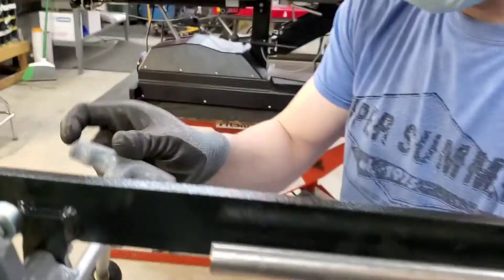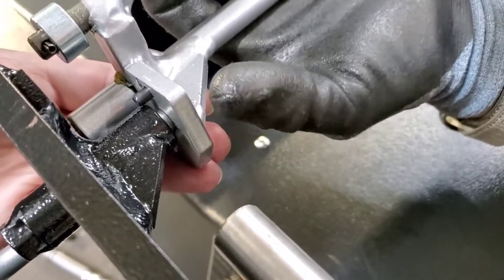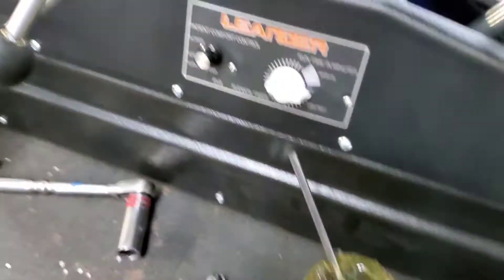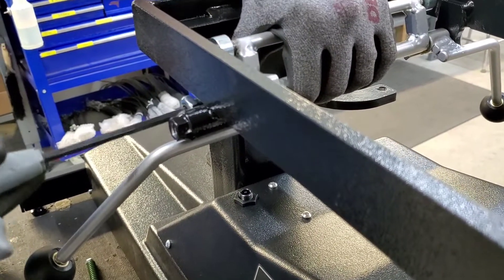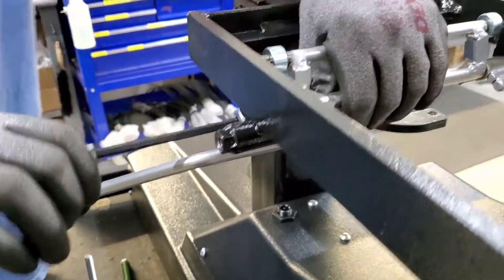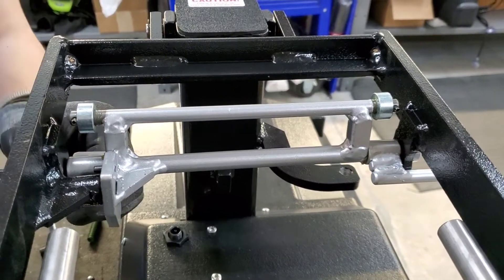Starting on the non-tension knob side, screw the set screw in with the nut until you can see a small gap between the ball bearing and the plate — somewhere between a 1/16th and 1/8th of an inch is fine, but you still want to be able to see through there. Then on the tension knob side, screw it in until you start to feel some resistance — that's the set screw hitting the bottom of the slot it goes into.